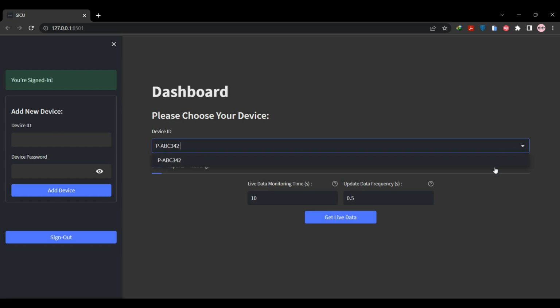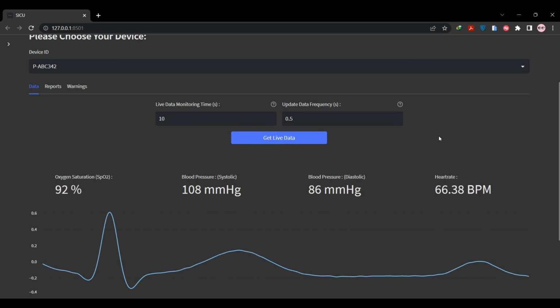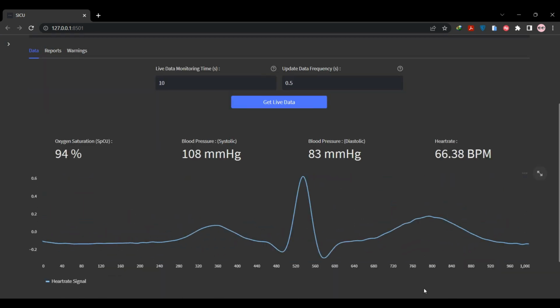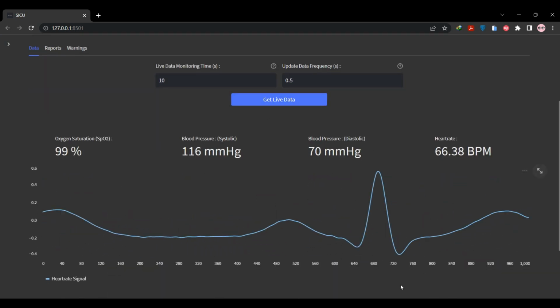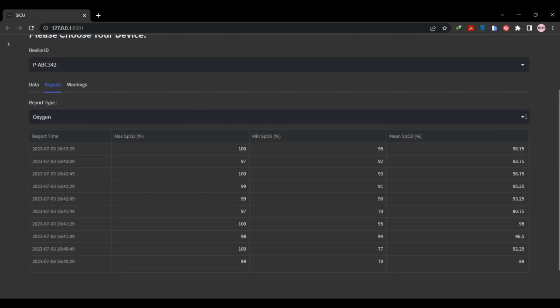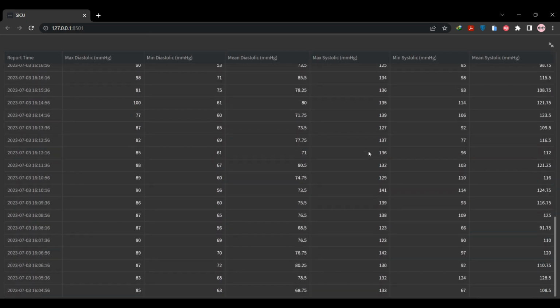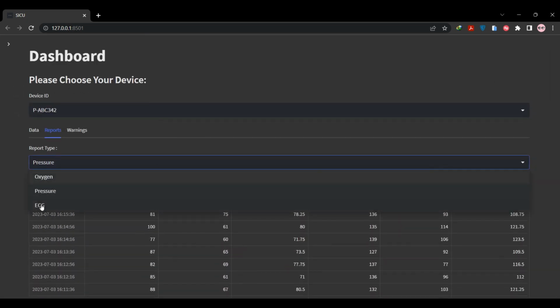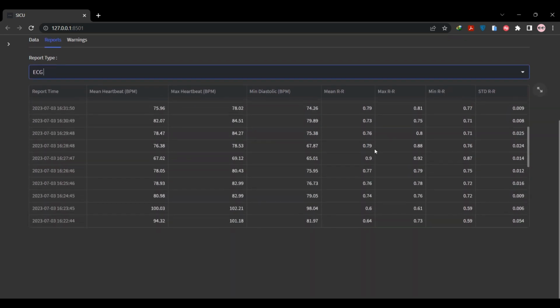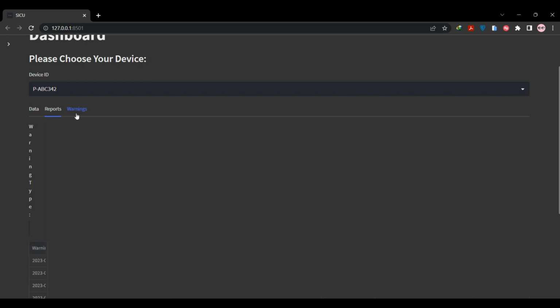In the data tab, as you can see, we can specify the amount of monitoring time and also the update data frequency and get the live data from the database. By pushing get live data, we are going to visualize the live data that is being stored in the database. In the reports tab, you can see the full list of the reports of different kinds of data categories, including the pressure, EKG, and oxygen. By specifying the report type, you can see the statistics that we have previously defined in our platform and also see the time that the report was created.